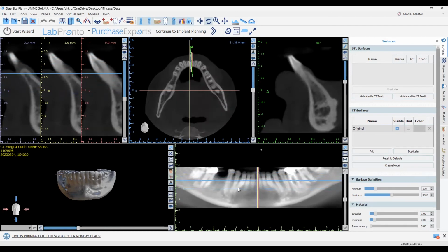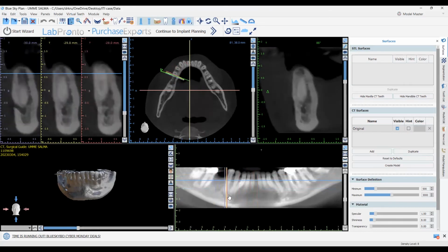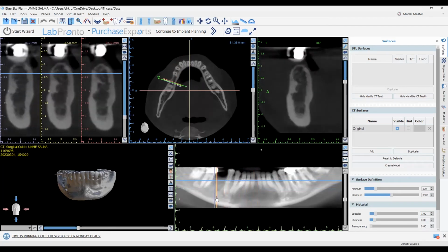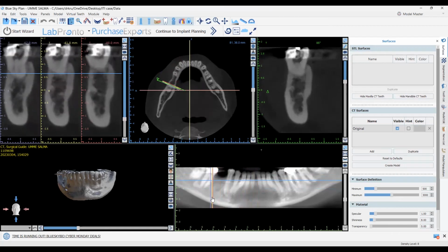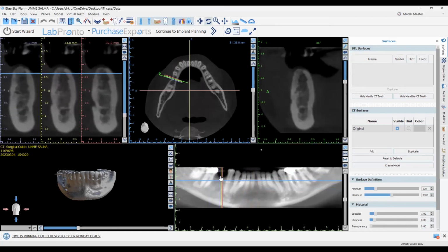This is how it moves. The lines seen on the panoramic view, when we start shifting, keep jumping to the next sections. So you can see accordingly in the 360-degree view and the cross-sectional view, it keeps moving. Different sections are visible.